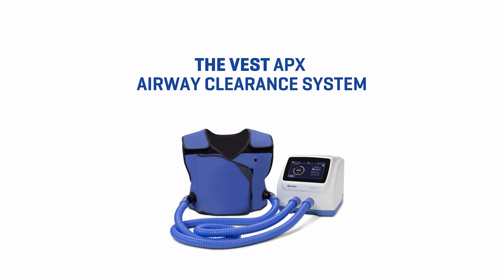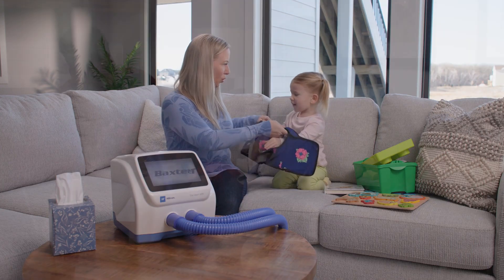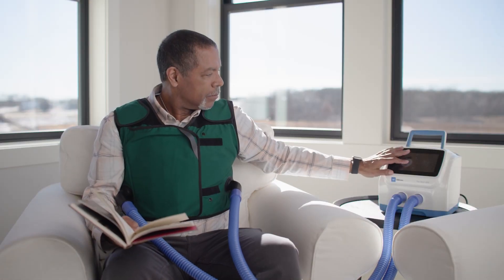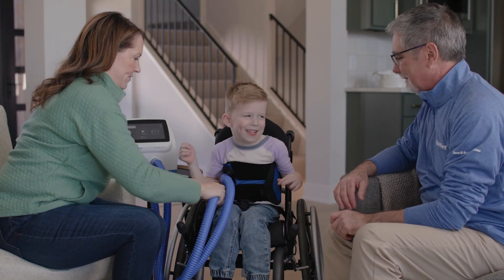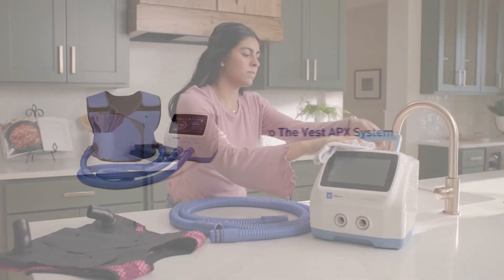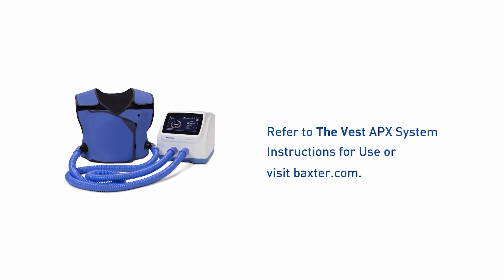The Vest APX Airway Clearance System is Baxter's new airway clearance device designed to provide non-invasive at-home therapy with all new comfort and ease. The Vest APX system is intended for pediatric to geriatric patients in the home care environment. This training video is designed to give you a system overview and provide instructions for use, including setup, use, and maintenance of the device. For additional details and information, please refer to the Vest APX system instructions for use or visit Baxter.com.